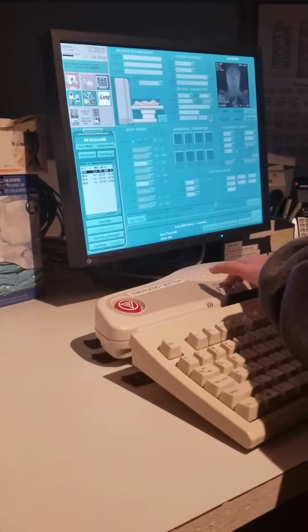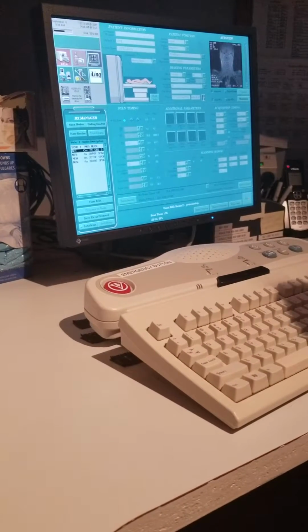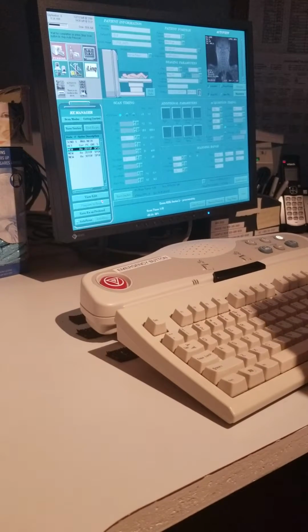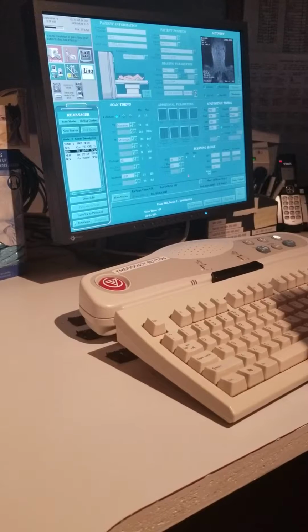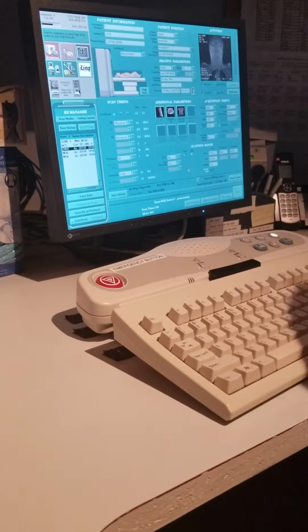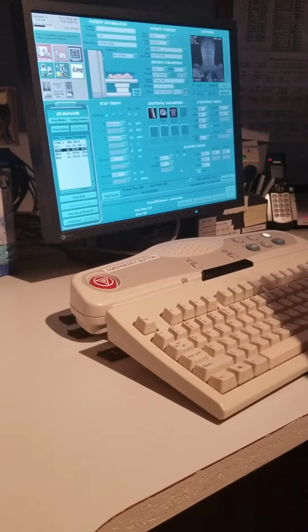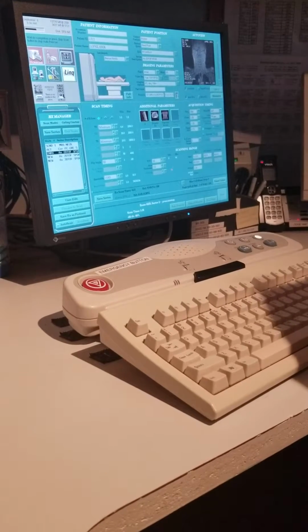Okay. Should I just stop him or just let him do it? Yeah, it's okay just to scan. That's not a problem. He wants to sleep. That's not a problem. Okay, so let's do this. It's different when you guys are testing, you know, practice. As long as you guys are good with that, then I'm okay with it. And I haven't tested you, so unfortunately, not all you guys did well on your tests. So I heard. Okay. All right.